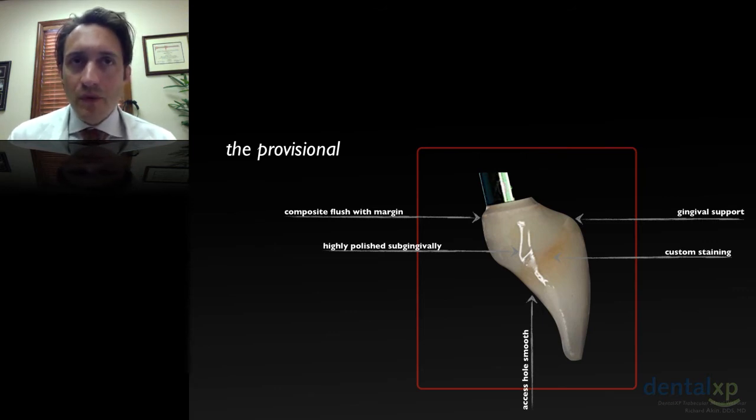The gingival support is really this area, and this is the area where I am most concerned from a facial gingival margin standpoint.